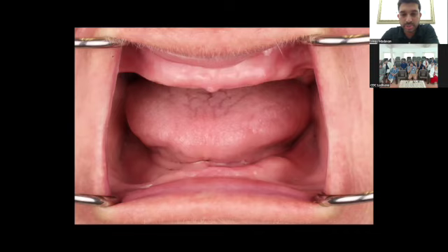So what you do in this case, because the patient did not come in with an existing denture, you want to set up your teeth. As I mentioned to you in the previous presentation, if I don't know where the teeth belong, I don't want to go ahead and jump and place the implants. I need to have a tooth setup. So in a case like this, because the patient had lost her denture, I decided to go ahead and make her an interim denture.